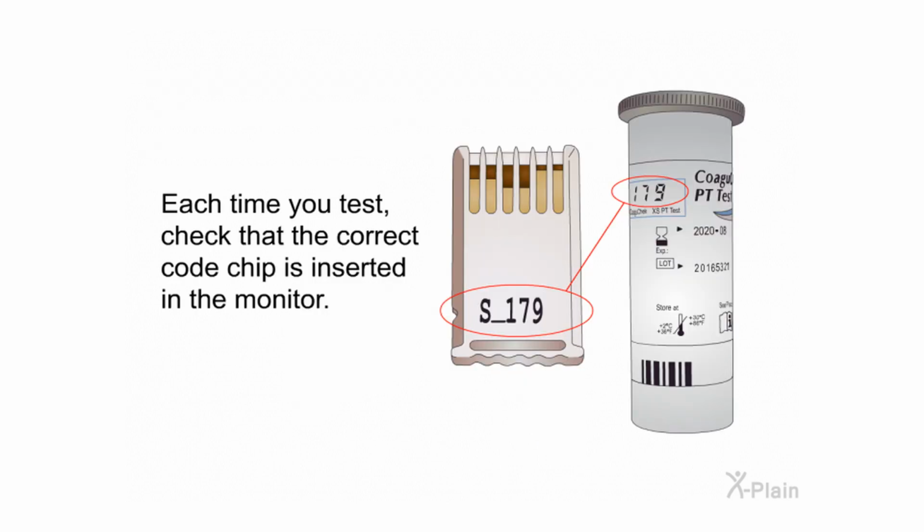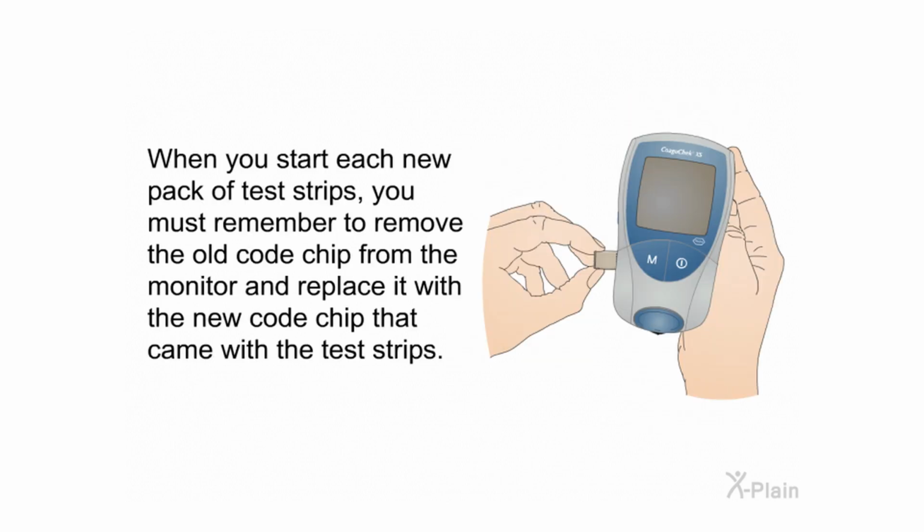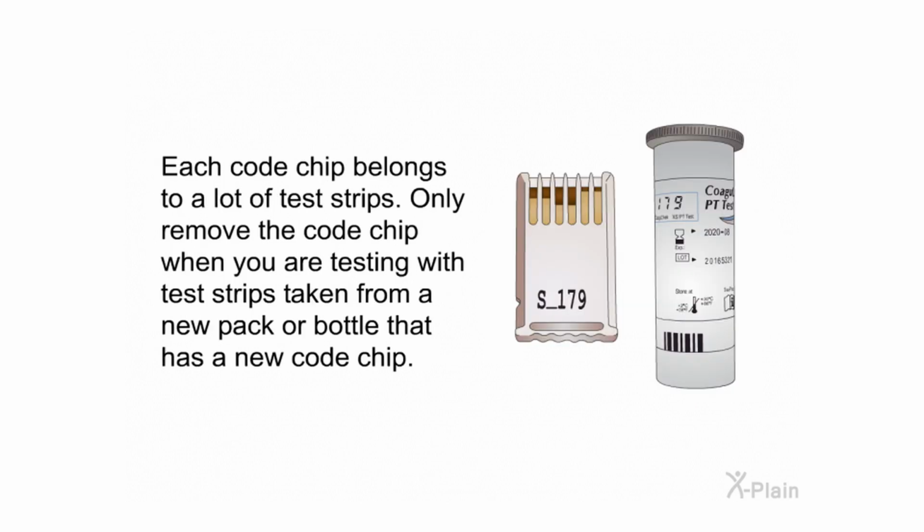Each time you test, check that the correct code chip is inserted in the monitor. When you start each new pack of test strips, you must remember to remove the old code chip from the monitor and replace it with the new code chip that came with the test strips. Each code chip belongs to a lot of test strips. Only remove the code chip when you are testing with test strips taken from a new pack or bottle that has a new code chip.